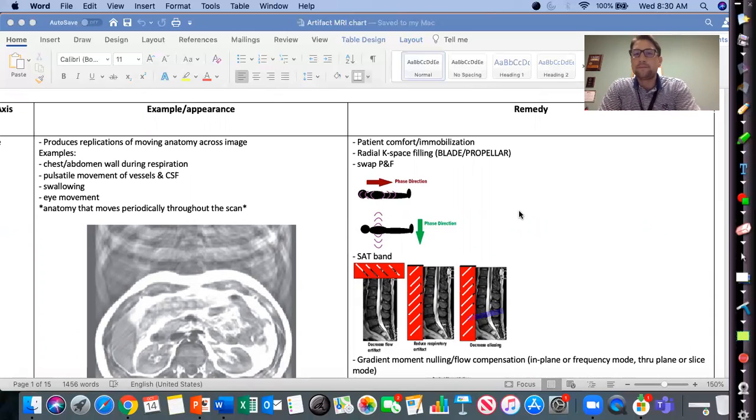So there are some immobilization methods to reduce motion artifact. And this is really dealing with like extremities, right? Like if you're scanning a foot, it's really important to make sure you really pack that foot into that coil with a bunch of sponges, because patients, they do think that they hold still throughout the scan, but sometimes even the slightest motion will create this artifact. So it's always real important, if you can, to use some type of immobilization method. And that's typically sponges in MRI.